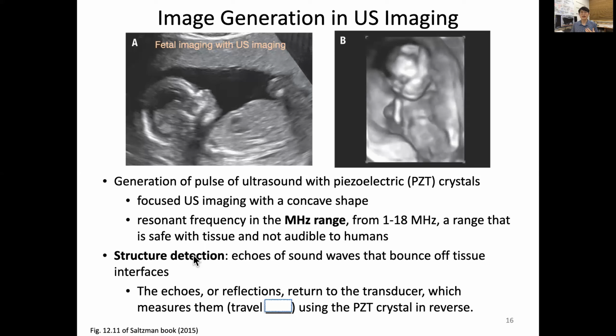Basically, it's the same as when we are in the mountains and we say, Yahoo, and the mountain in front of us will have our sound wave reflected back, and we hear the echo. Based on the time of this echo, we calculate the distance of the mountain in front of us, whether it's closer or far.